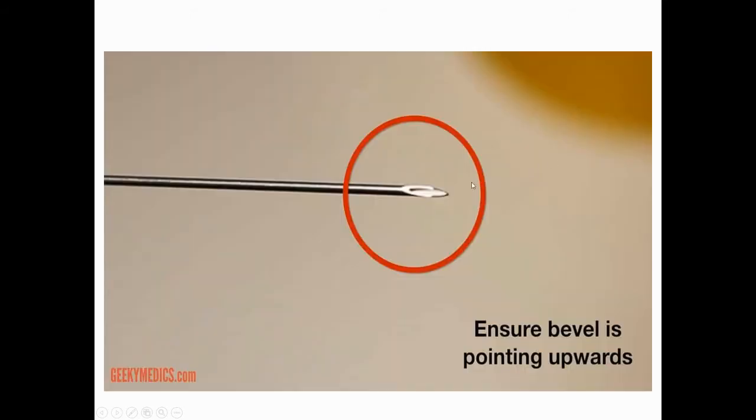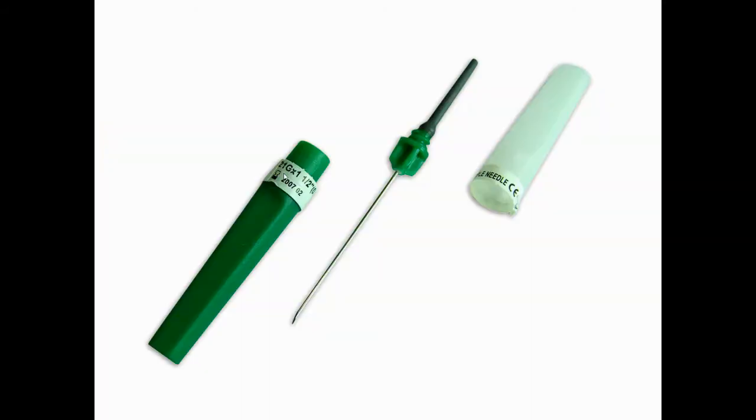So first is the bevel. It should be facing upwards, or pointing upwards, not tilted or facing down, so that you are able to obtain samples properly. So first is an example of the vacutainer method or the vacutainer tube.